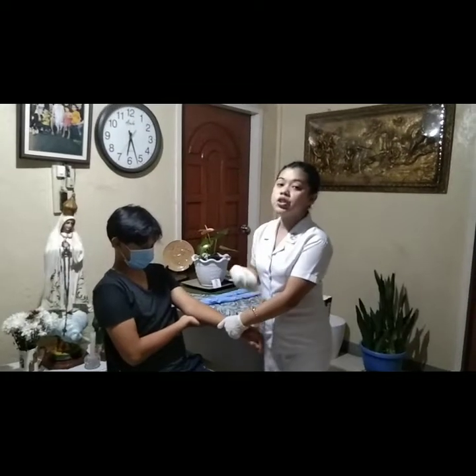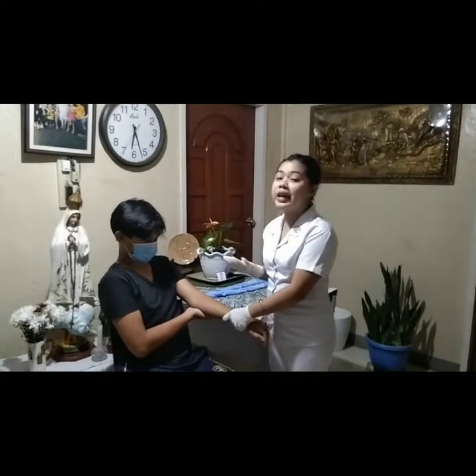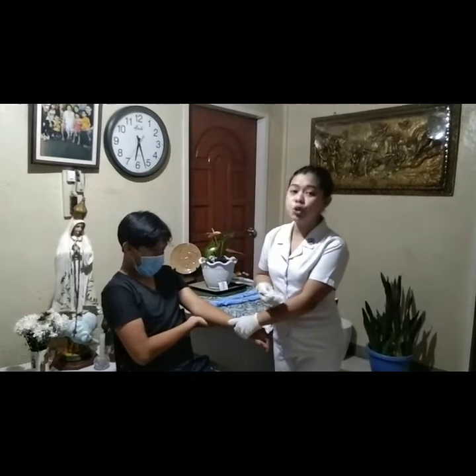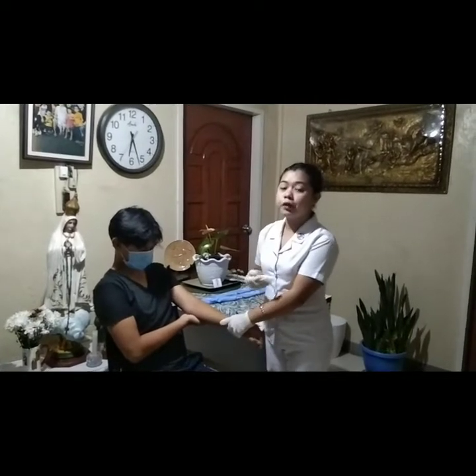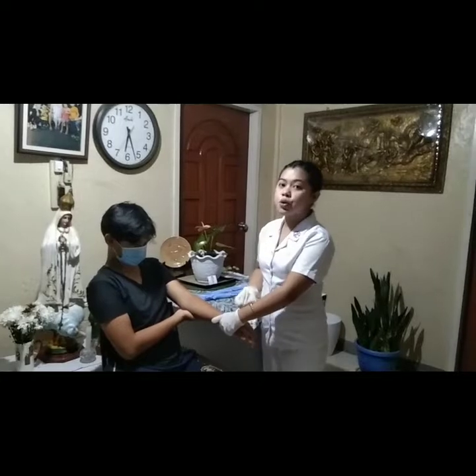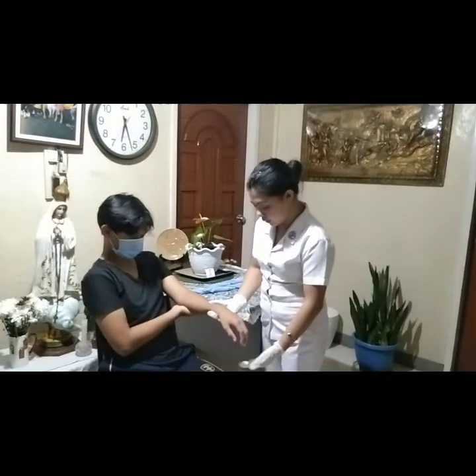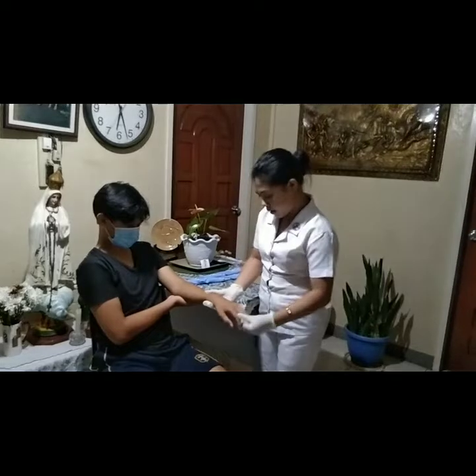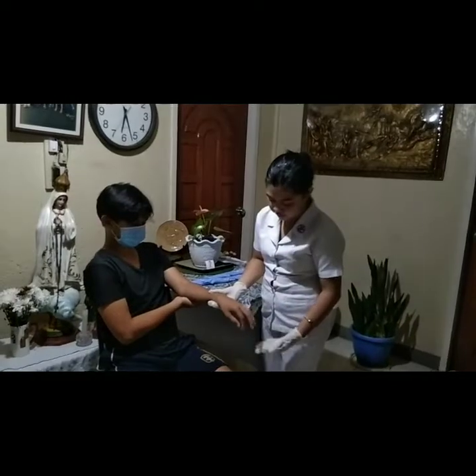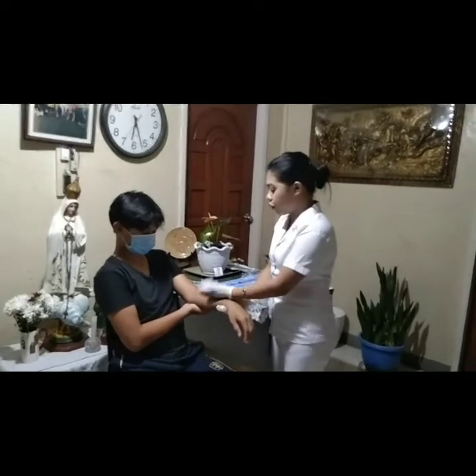Next is to check for the circulation. We should check for the feeling, for the warmth, and the color. This will ensure that adequate perfusion still reaches the affected extremity. So let's check first the feeling. Sir, can you feel? Yes. Sir, please move your fingers. Okay, sir. Next, we will check for the warmth.